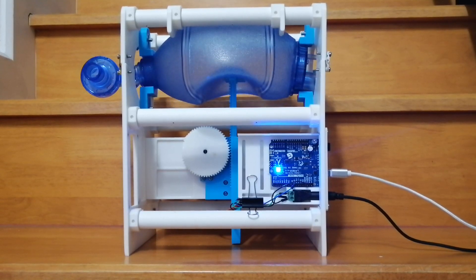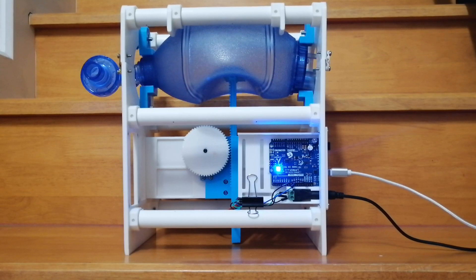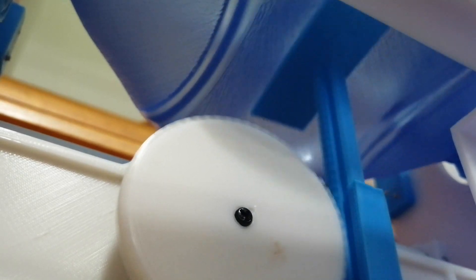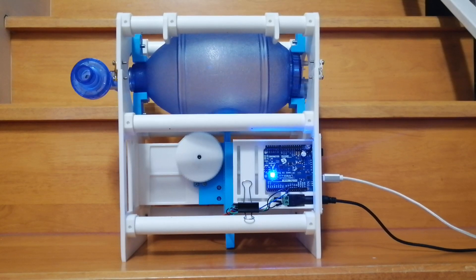This is our 3D printed, open-source ventilator project. It uses an Arduino-controlled, servo-driven linear actuator to compress a common resuscitation bag. Controls enable users to set the rate of compressions as well as the percentage the actuator presses on the resuscitation bag.